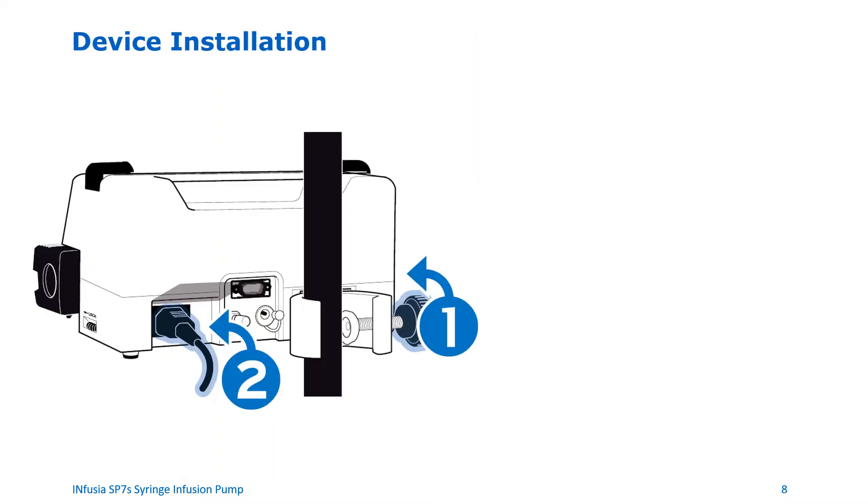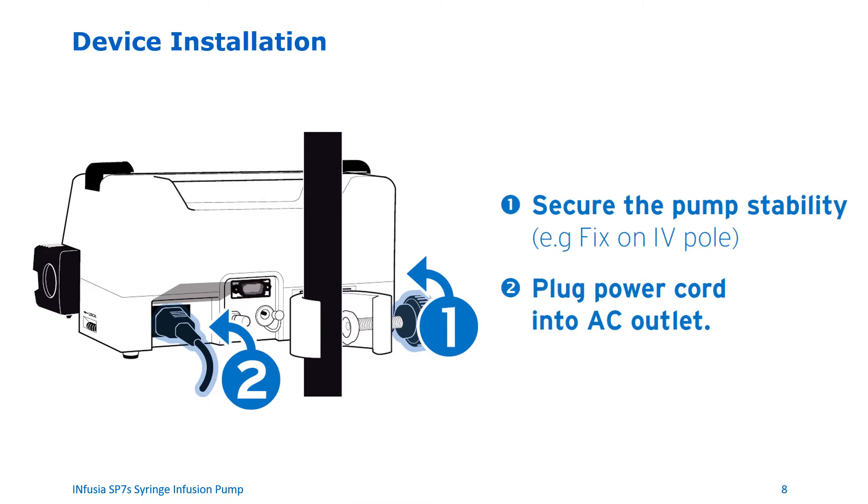Installation of the device. Use the pole clamp on the back of the device to attach the device to an IV pole or to a cage. Then plug the power cord into the AC power outlet.